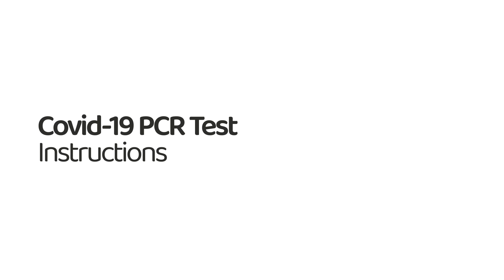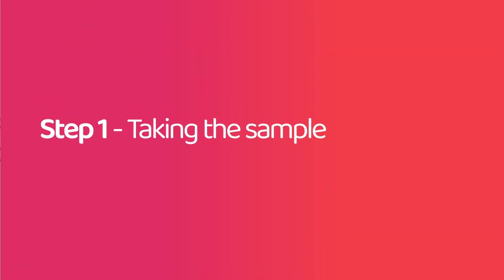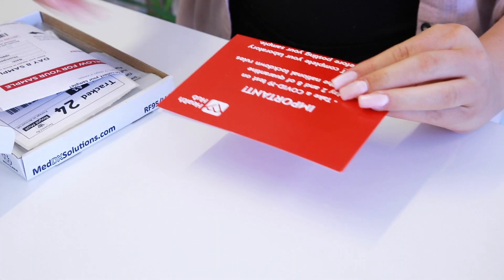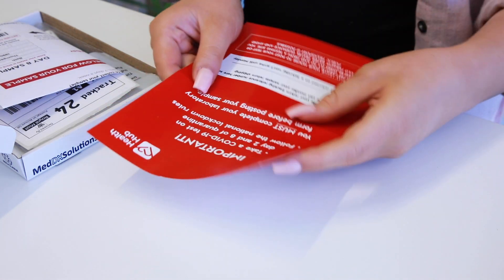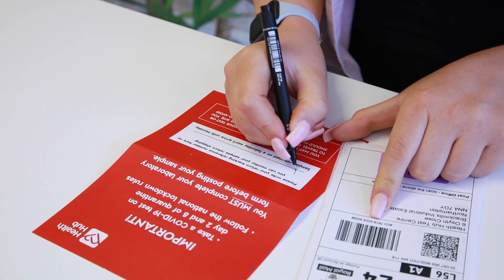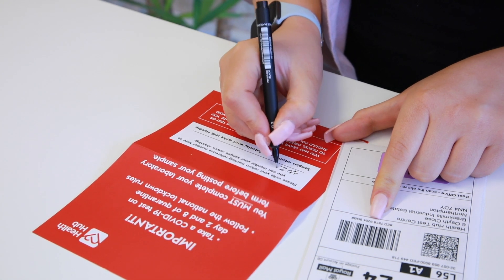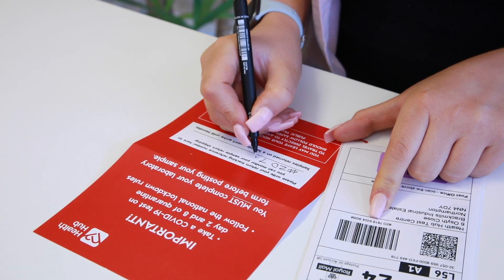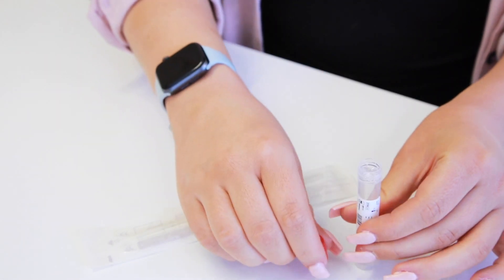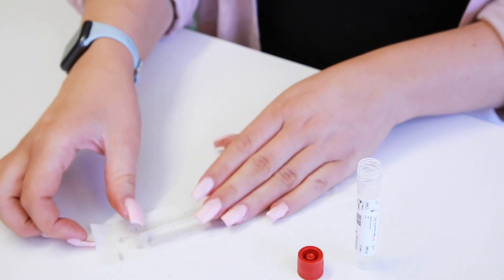How to take your coronavirus home swab test. Step 1: Taking the sample. First, open your test packet and read the enclosed instructions carefully, as they may differ slightly to those in this video. Next, be sure to make a note of the return tracking number provided. Unscrew the lid from the collection tube, being careful not to spill the fluid inside. Remove the swab from its packaging.